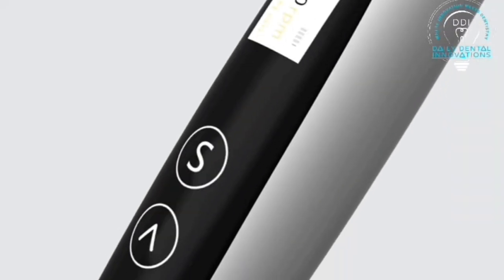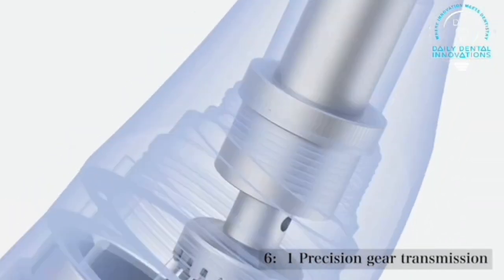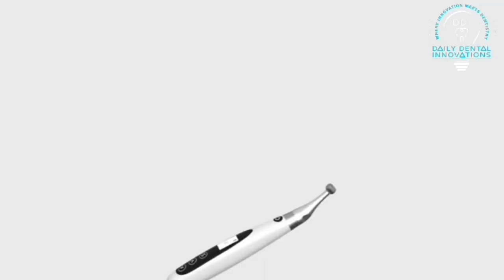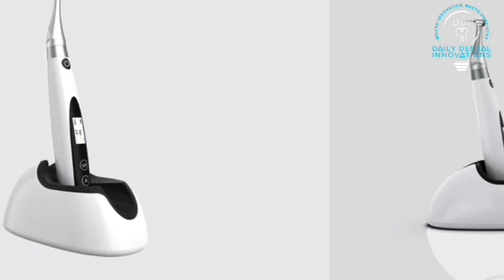They also have a reciprocation mode, about which I'll talk in detail. This endomotor is a brushless endomotor, and hence the noise is less and the life can be longer — again, according to the manufacturer. It has a base on which the handpiece can be held in two different ways, for charging and also for keeping it when not working.